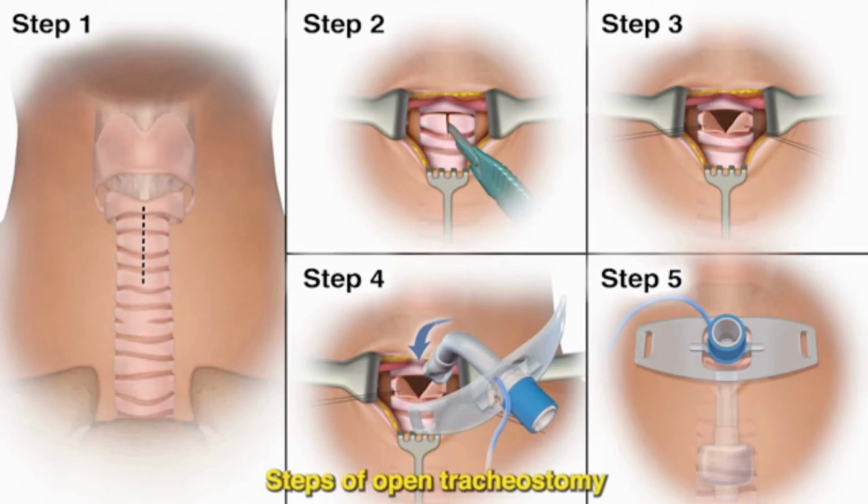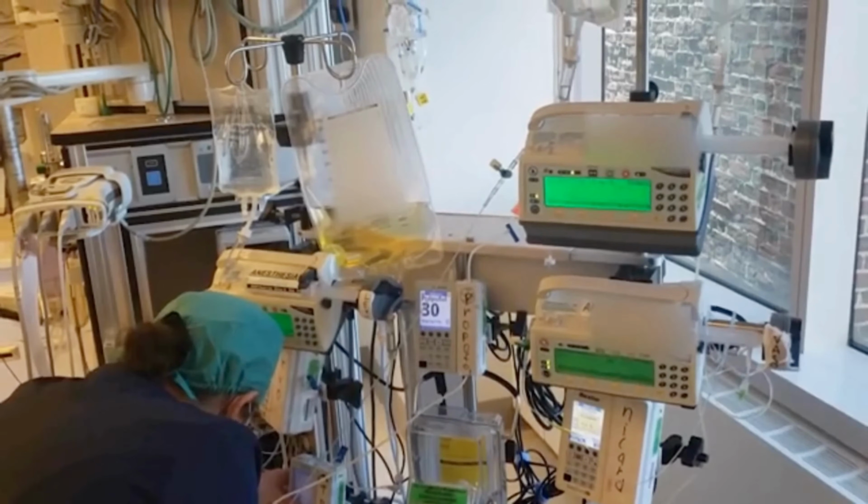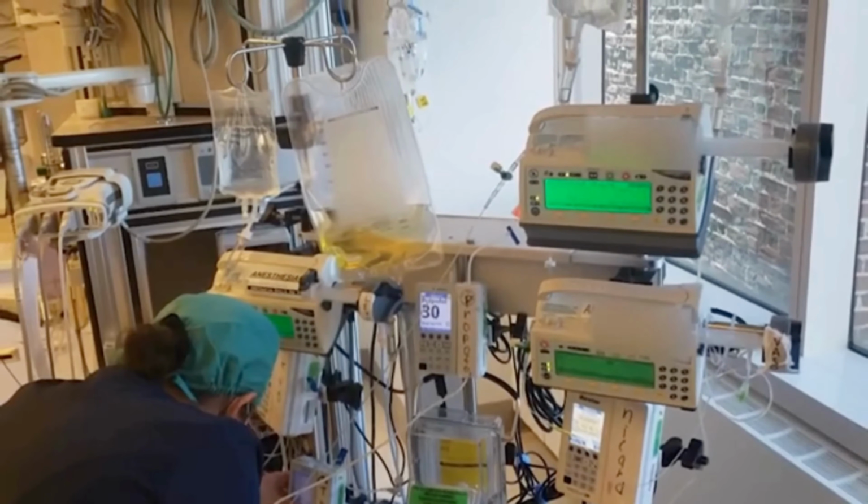Advance it just far enough to seat the cuff. Inflate the cuff. Ventilate the patient. Confirm placement with chest rise and end tidal CO2.